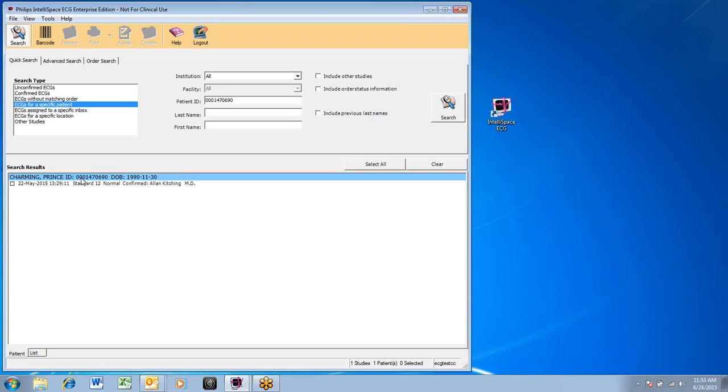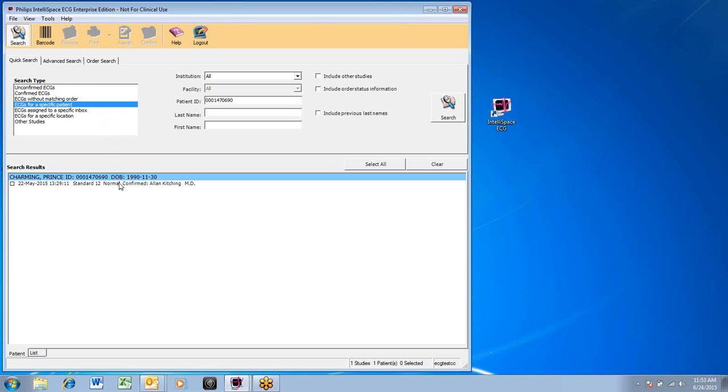Double click on the ECG you want to review for this patient, or you can click the box beside the patient's name, then click the review button on the top. The ECG is displayed on the screen.